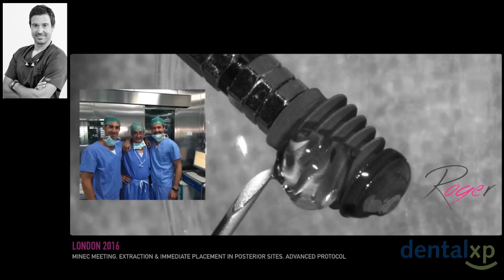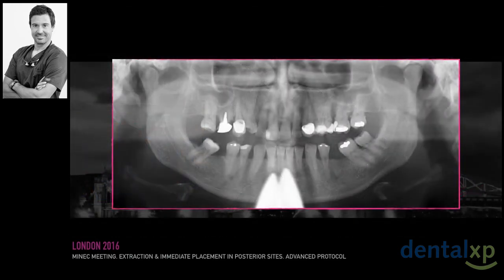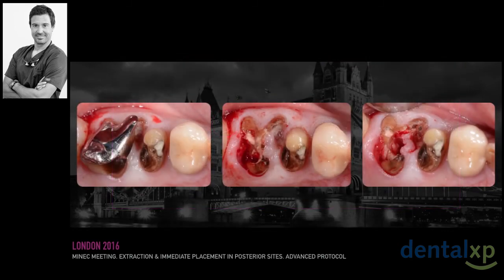This is my case number 2. This is my father in the middle, the gastric surgeon. My brother and I joined him in his last day of public service surgery, and I owe him my life. So he came to me and asked me to place some implants on him. We took a panoramic and a CBCT, and planned surgery on his upper right molar under the same protocol. The only difference was that we were going to perform an atraumatic sinus lift at the time of extraction and implant placement. So we followed the protocol.